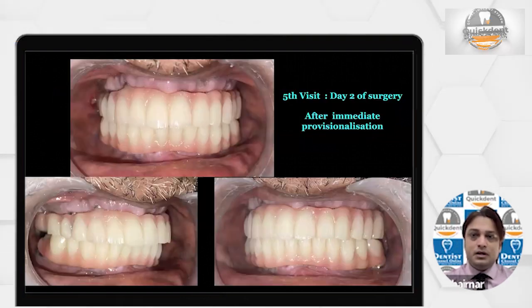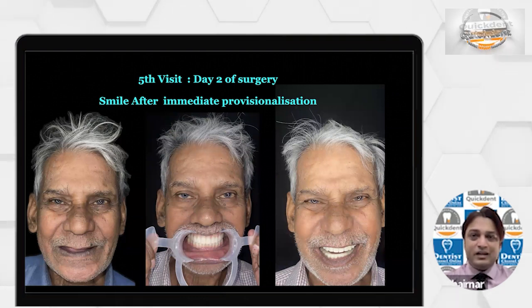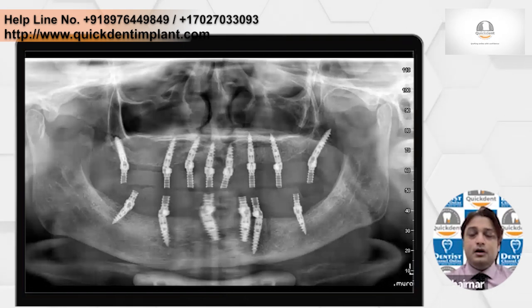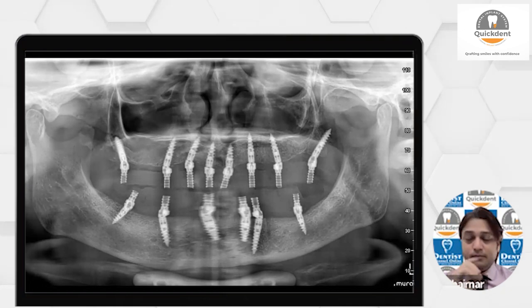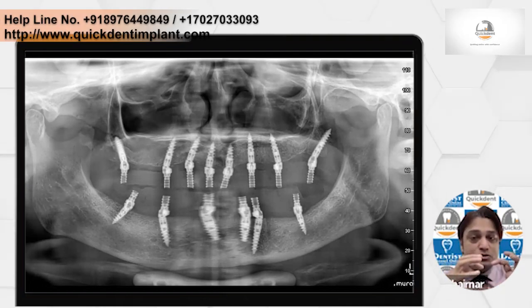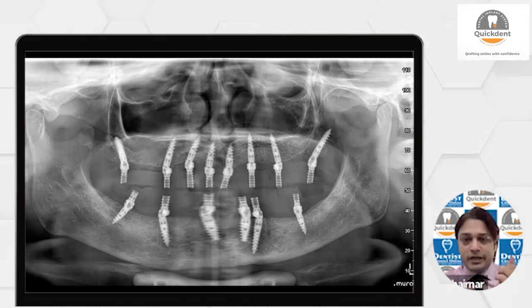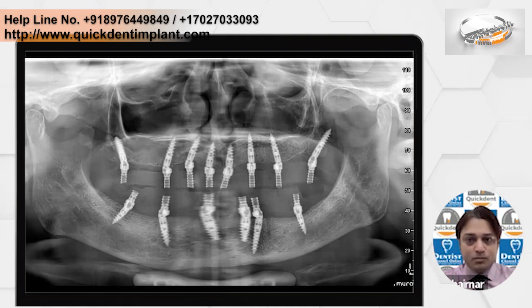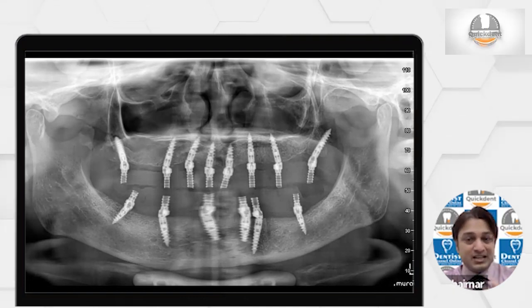This is delivered to the patient on day 2. So this is the process. On day 2 of the surgery, the patient is receiving a transitional prosthesis. This is the X-ray of the patient. The only thing I am worried about is that this is not having any metal inside it. So there is a chance that if your prosthesis is not strong enough, it breaks and can jeopardize your implant. That's why always send it to the technician on day 2 for reinforcing, to make it thicker and add more bulky material for at least 2 months, so that it doesn't break. And compulsorily, after 2 months you have to change it.